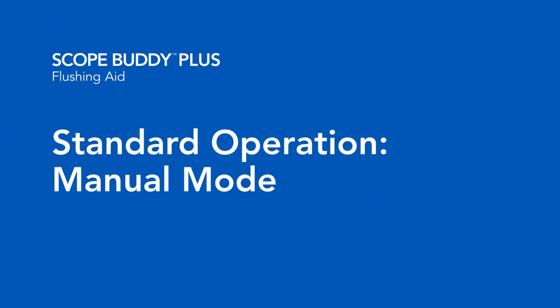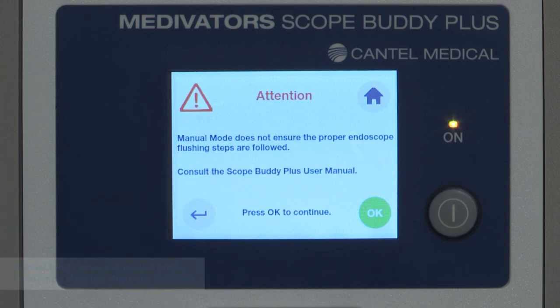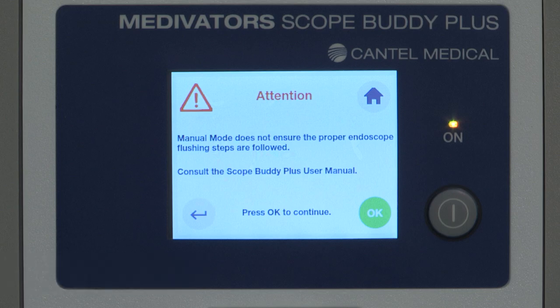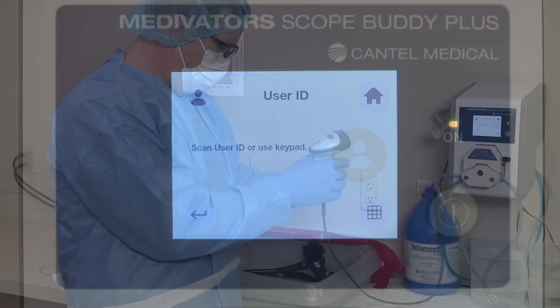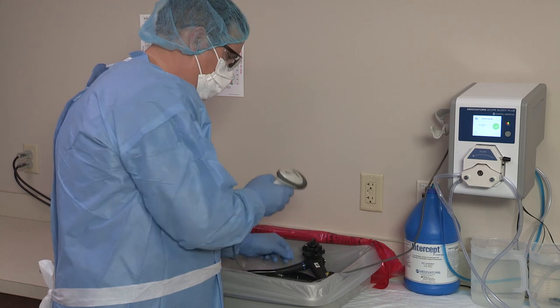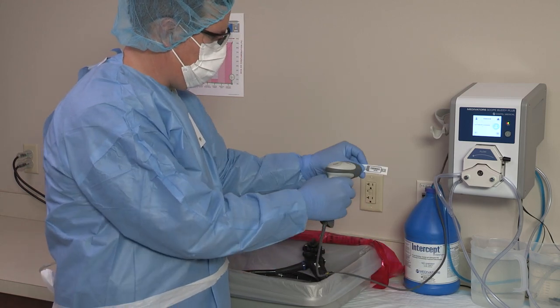This segment reviews how to use the manual mode with the Scope Buddy Plus Flushing Aid. Select manual mode from the home screen. Note that manual mode does not ensure the proper endoscope manual cleaning steps are followed, because the user selects each step; therefore, the data that is tracked will not be complete. Press OK to advance. At the beginning of every cycle, you will be prompted to enter the identification numbers for the user, endoscope, and patient if enabled, using the barcode scanner or manually by selecting the keypad icon.